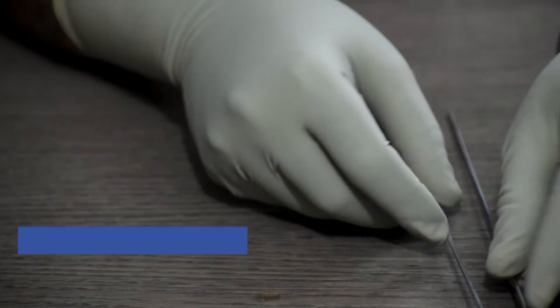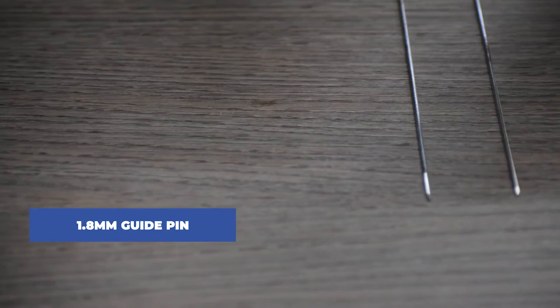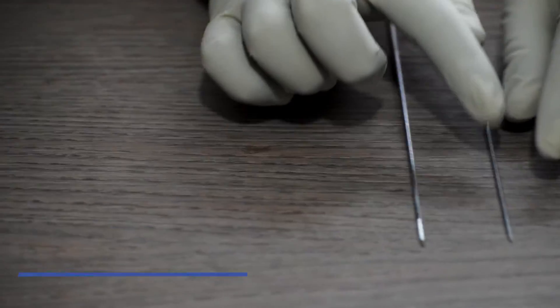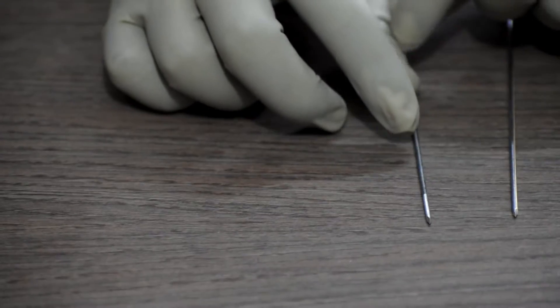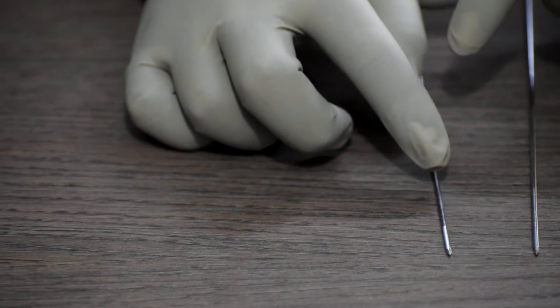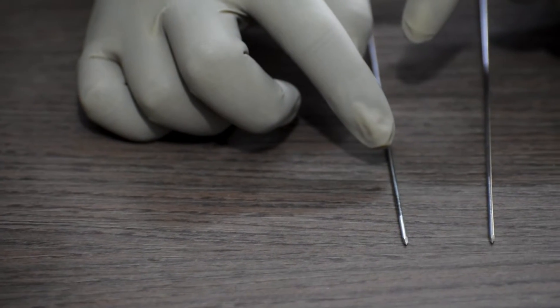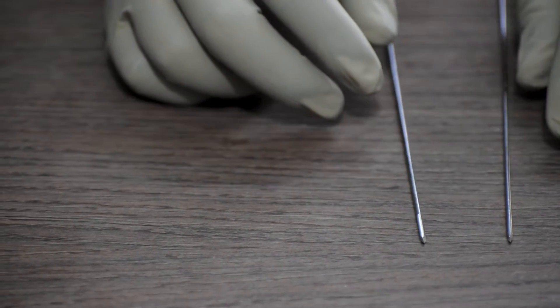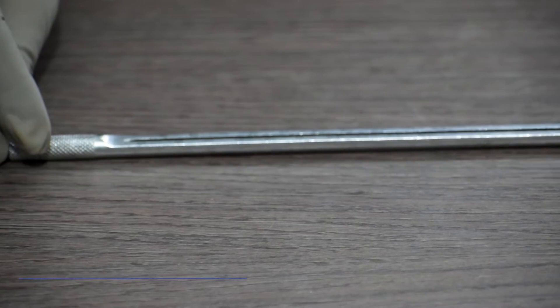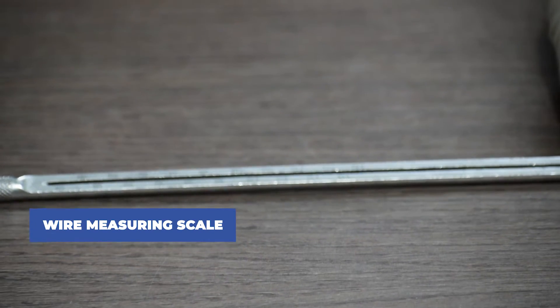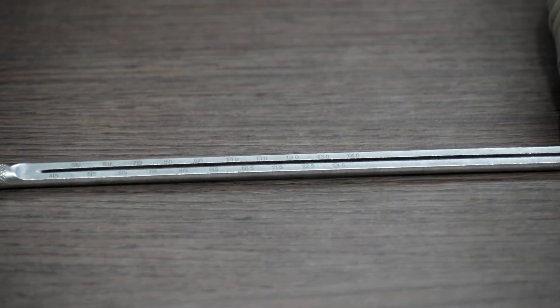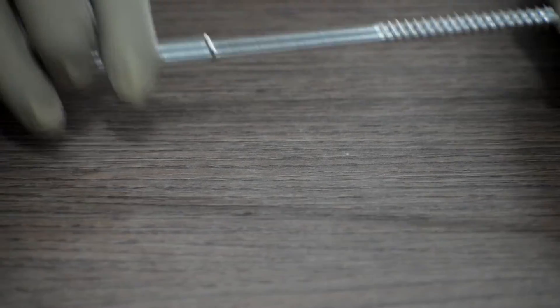Coming to the instruments, we will require guide pin or guide wire, plain and threaded. This one is plain and this one is threaded, 1.8mm. It will be used as per surgeon's preference, so we have to provide both. Next, we will require a wire measuring scale to measure the length of the guide pin or guide wire. There are markings on the flat surface to record the length.